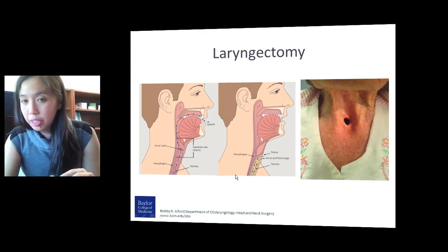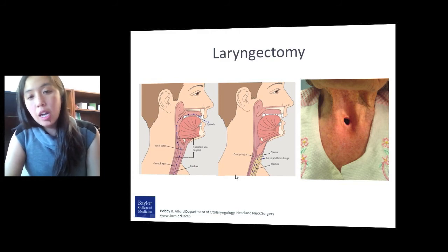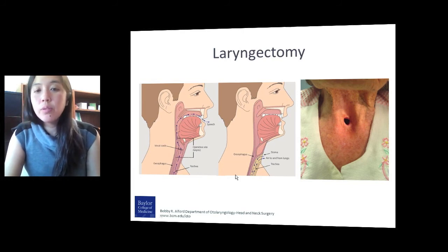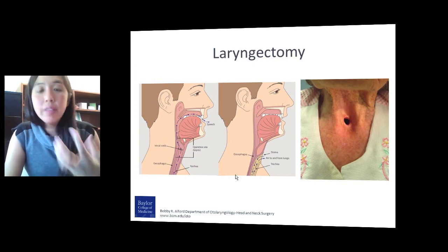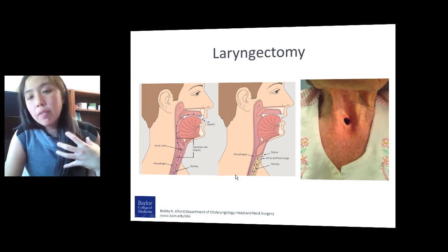For a laryngectomy patient, however, if you want to rehabilitate voice and speech, you have to find a different type of vibrator. Remember, the larynx is just a vibrator, but you have to find some other sound source. Different options include an electrolarynx, which is that mechanical sound. It's usually a gray contraption that they put up next to their skin or their mouth, and it's really just a diaphragm that vibrates, causes their pharynx to vibrate, and they shape that vibration sound into words.